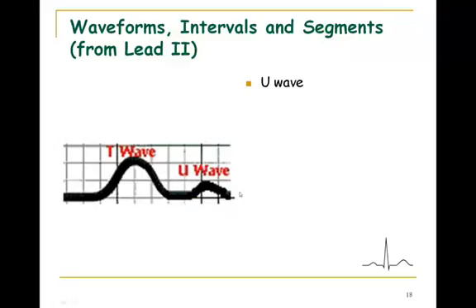The U wave, or that wave of unknown origin, you saw when I showed you hypokalemia. But some people we see this in, and it may not indicate that anything's necessarily wrong. Usually, if you start seeing a U wave, it may indicate that some area of the ventricle is repolarizing a little bit later or a little bit slower than normal. So don't always think that if you see a U wave there's something terribly wrong with this person. You need to look at the entire picture.